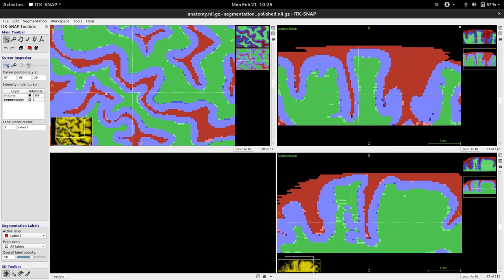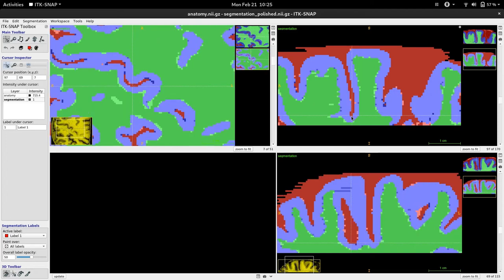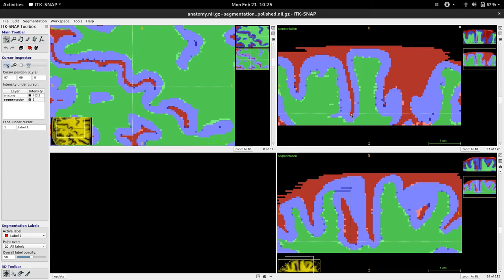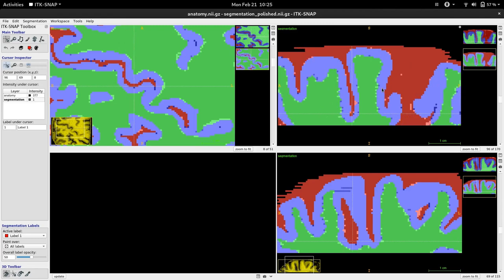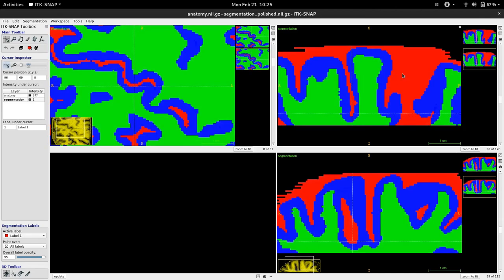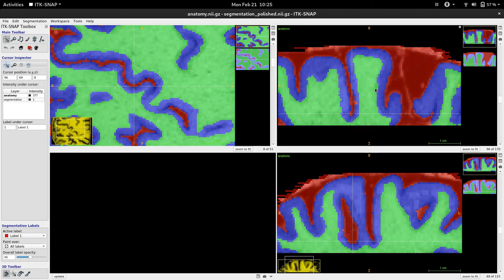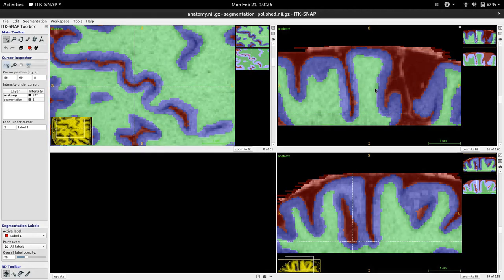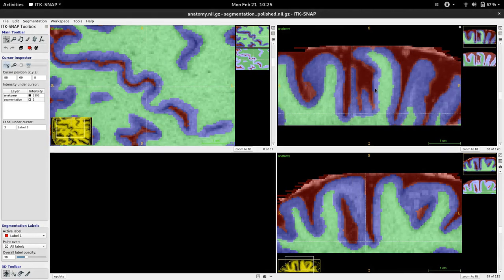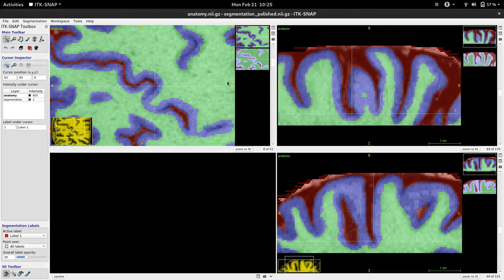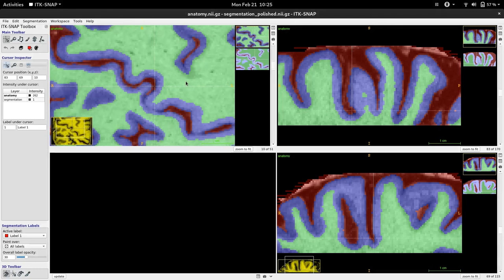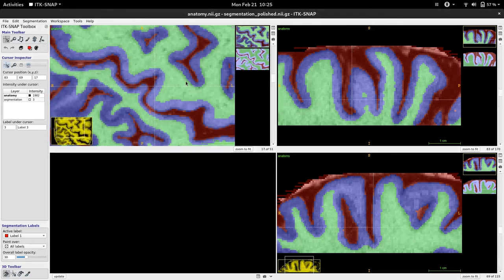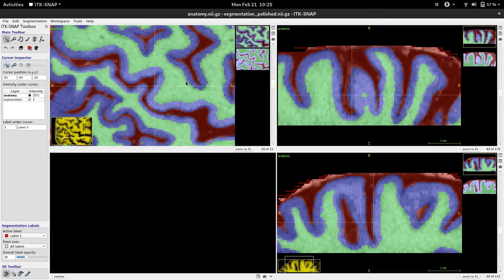While still preserving details such as the sulcus, of course always check your segmentation and how well it fits to your anatomical image separately. But that's it for today. Thanks.